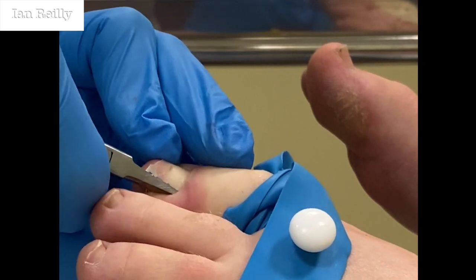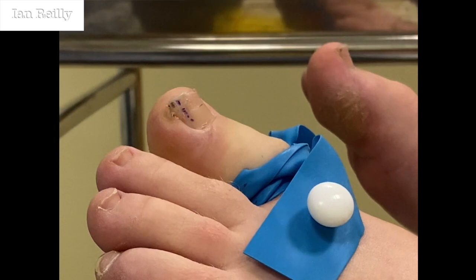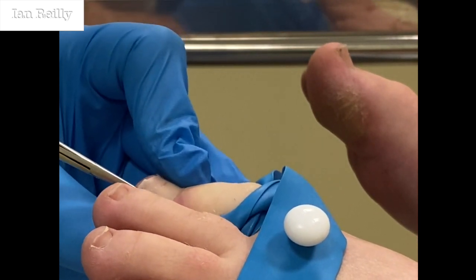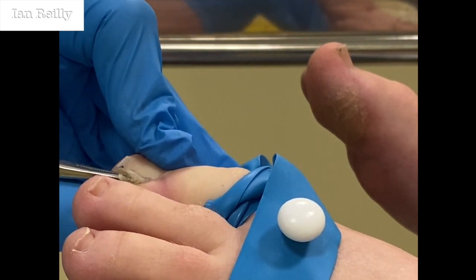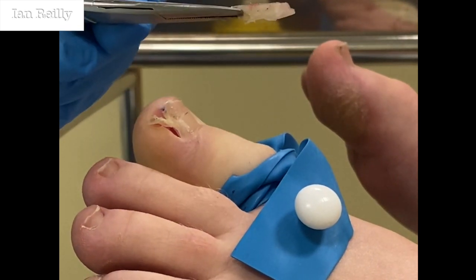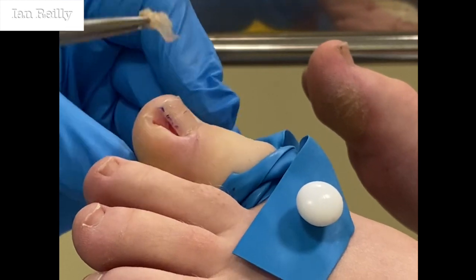So we've got these nice disposable nail snippers. When I say nice, perhaps that's not quite the right word. And then we're just going to rotate that section of nail out. So there's the nail that's causing the trouble. Let's regrow back. There's a little bit of skin.